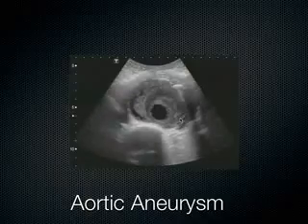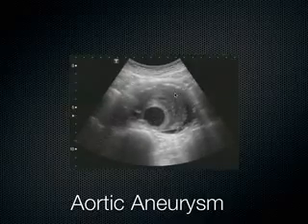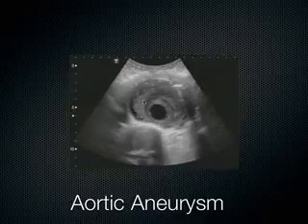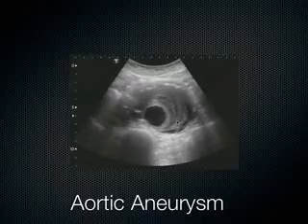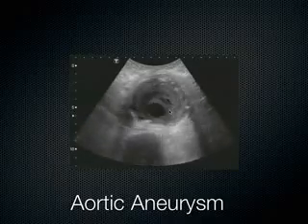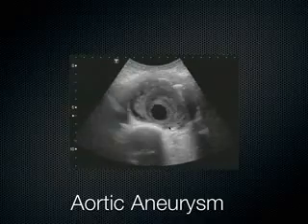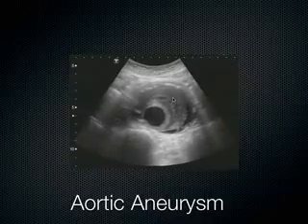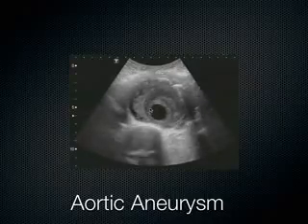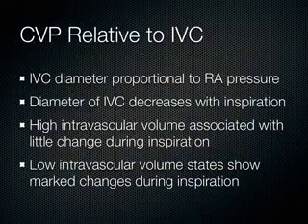And the reason you don't feel these on physical exam is because of all this clot right here. So this is the true lumen. This is all this congealed stuff back here. This is the clot. And you won't feel the pulsatility of the aneurysm on the physical exam, because the clot dampens the pulsatility with all of this congealed material here. So yeah, it's pulsatile down here, but that doesn't transfer so much towards the skin line. So that's why we miss these on physical exam about half the time.